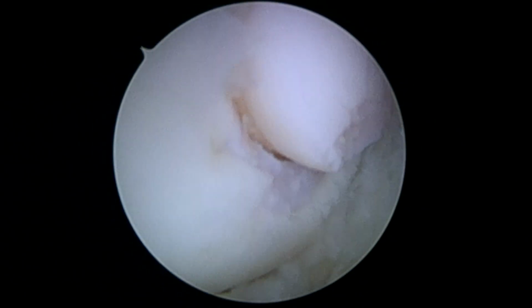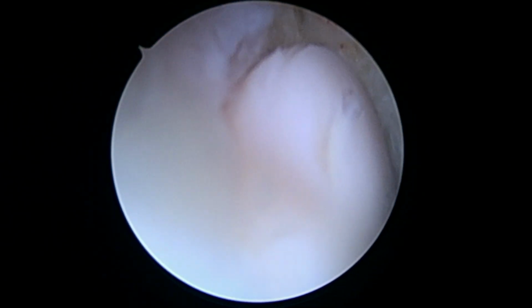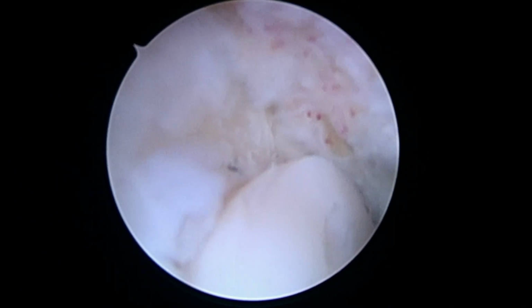Okay, so we've got the plug in, and you can see, let me get to where I can show you the depth. It's pretty much matched up right with the articular cartilage. So I'm happy with that. There's the normal, there's the plug, and you can see there's really not much room around it. So we're going to finish up here and get you back to the recovery room shortly.